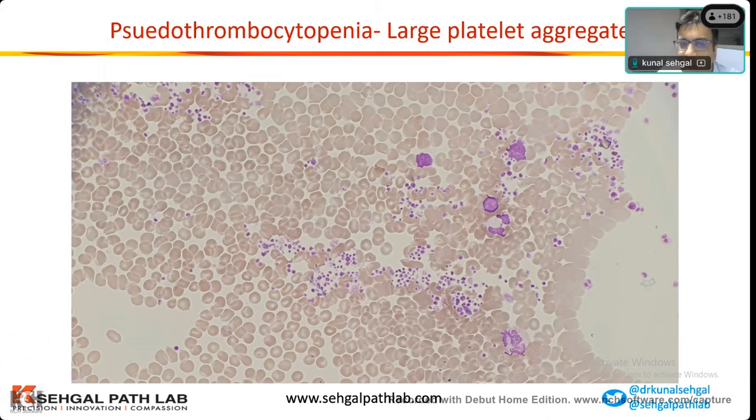Very true. So what ma'am was saying is, if you keep focusing on histograms, you will start picking up subtle clues of microcytosis. You will start seeing a little higher RDW, say a value of 16, 17 with an MCV of 78, which you may ignore. But this could be an early iron deficiency anemia starting in this patient, and it becomes very clinically relevant. Unfortunately, in our country, across the social classes, whether poor, middle class, or rich, iron deficiency anemia is extremely common. So we have a very important role in identifying this and helping our patients.